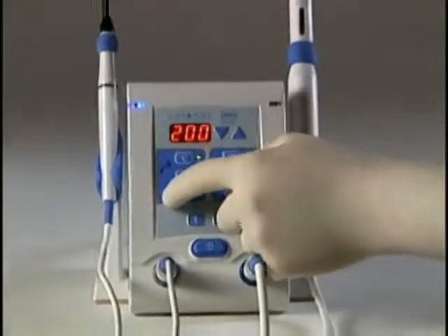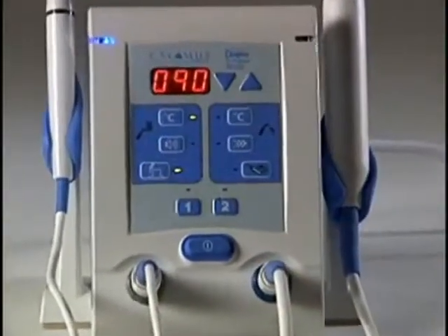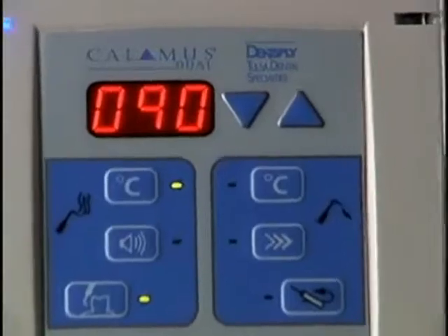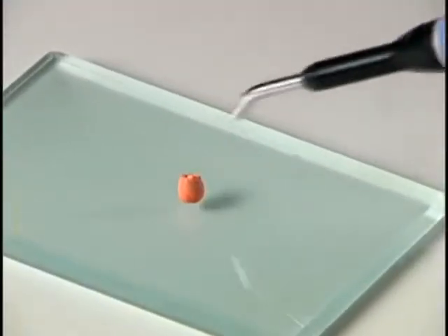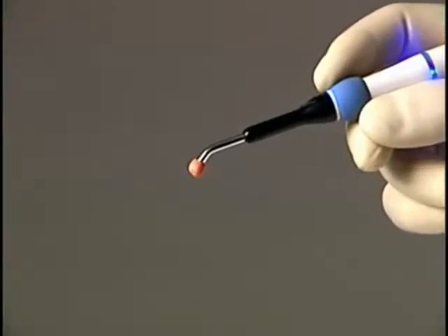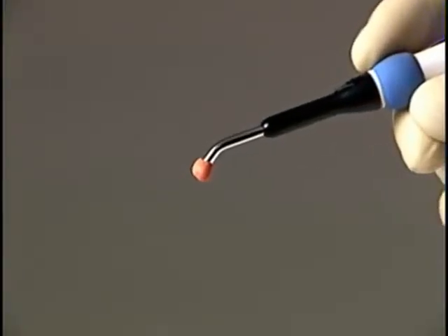Always press the TR button to set the temperature to 90 degrees C before starting the pulp sensitivity test. Place gutta percha on the tip of the thermal response tip before applying the tip to the patient's tooth. Do not place the tip directly on the tooth.